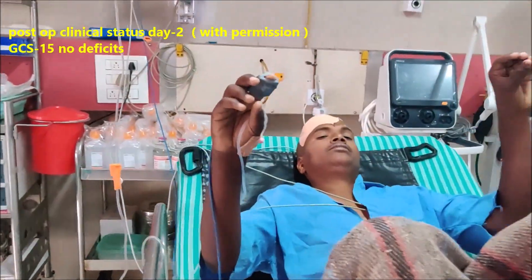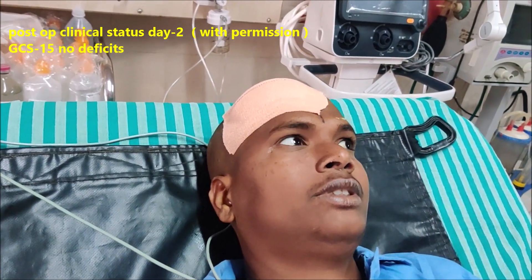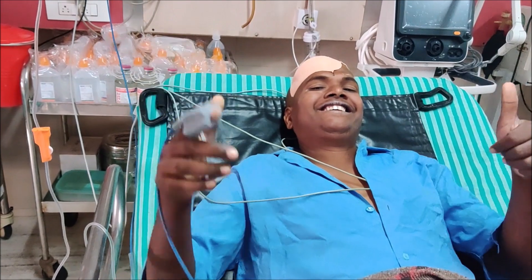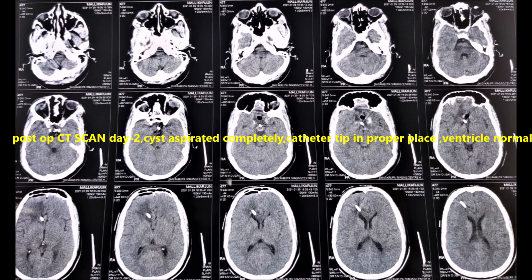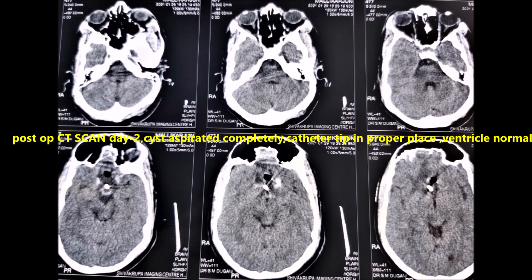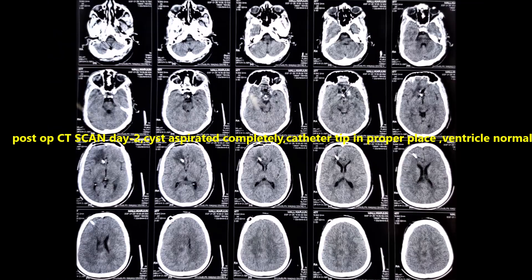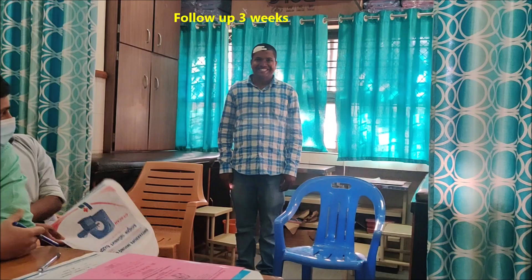This is his postoperative clinical status on day two — no neurological deficits, headache has resolved, he is taking orally and quite happy, shifting out of the ICU. The same evening we obtained a CT scan brain to assess the cyst contents and catheter tip. They are perfectly in place, the catheter has gone through the frontal route, the cyst has completely collapsed, and the ventricles are normal.